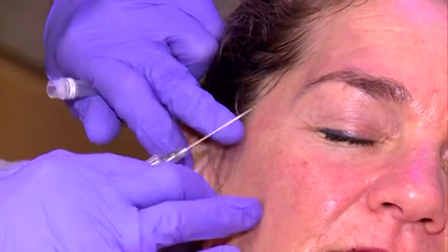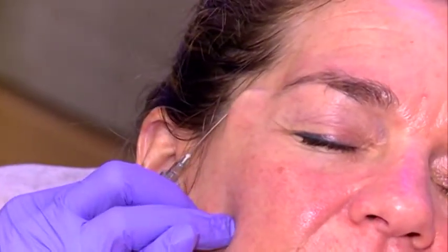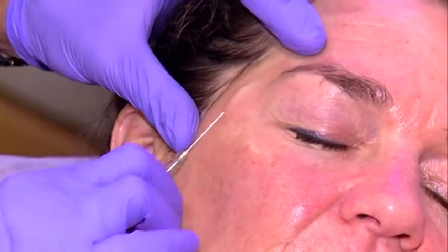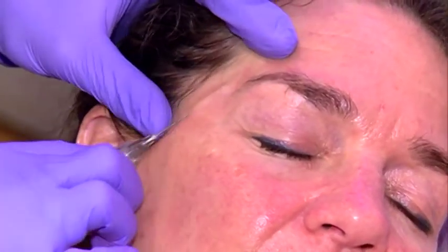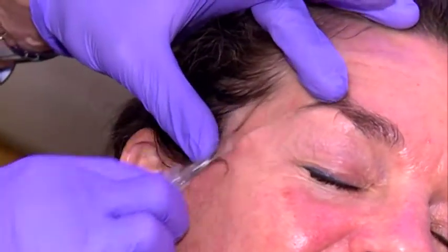So now my bevel is up, stretching the skin. And what I'm doing here, this is my plane of injection. It's subdermal injection, clearly to see. And what I would like to do is, I'm stretching it and I'm doing a kind of subcision. Sorry, this is discomfort. Sorry, is it okay? I'm fine. You're fine. You let me know if I'm too rude.